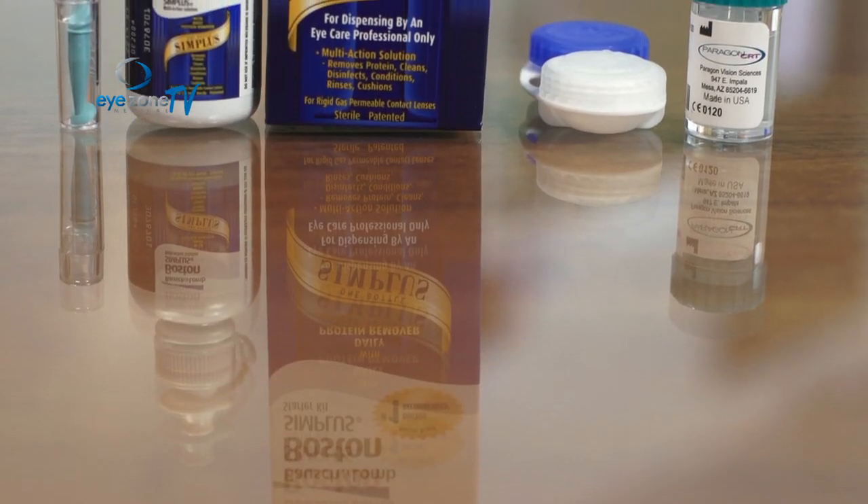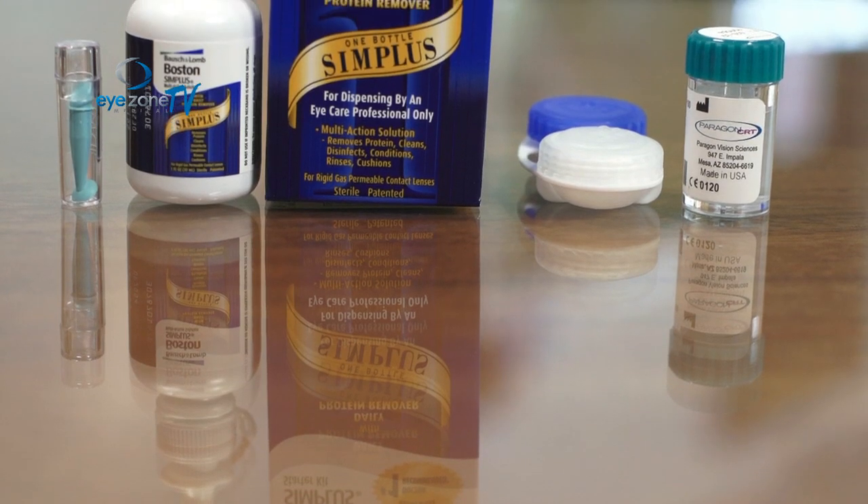Today we've learned how to put in your contact lens, how to take it out, and how to keep them clean so that you can have a successful corneal refractive therapy treatment.